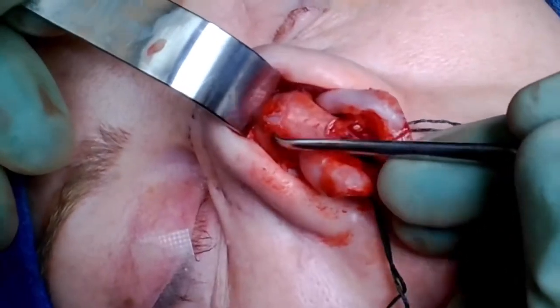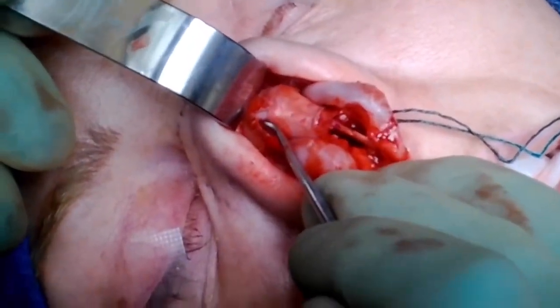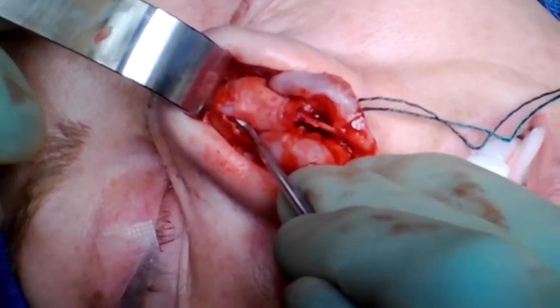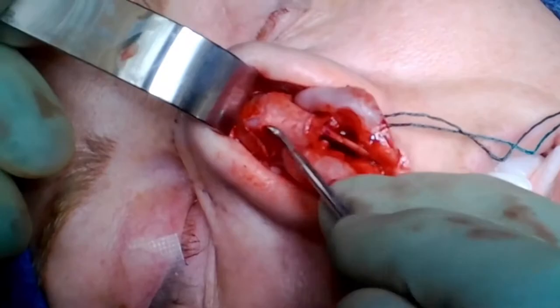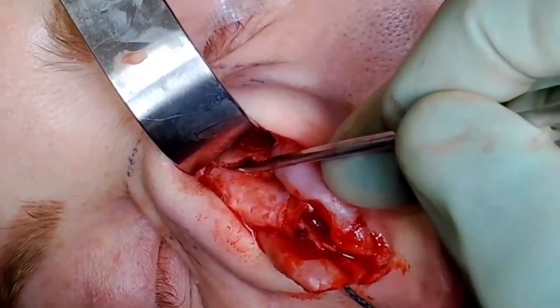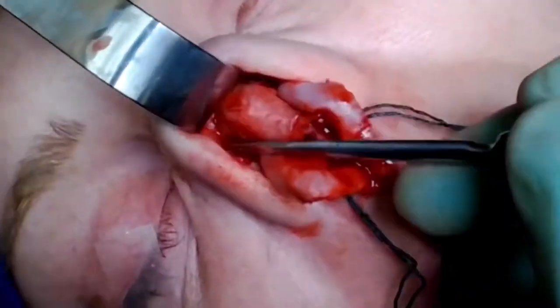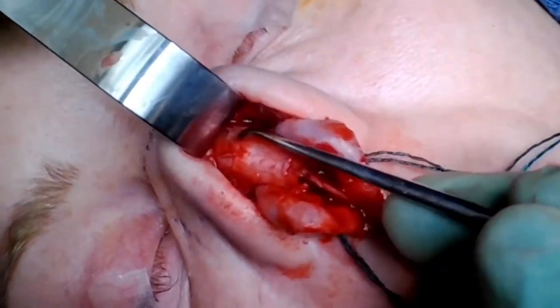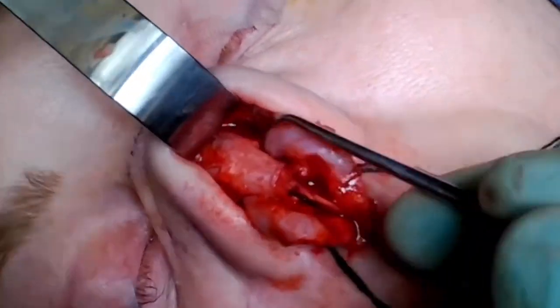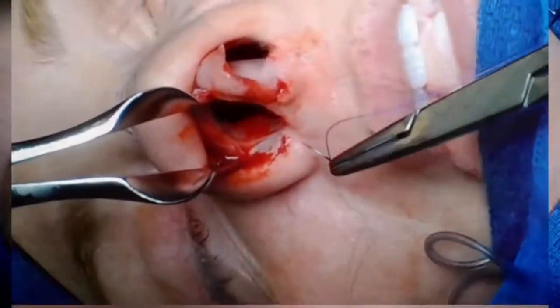This isn't always necessary, but it was in this case — this is a lateral keystone area release. I take a sharp caudal and I'm separating the upper lateral cartilages from the nasal bones. You need to be conservative and go slow. You don't want to damage the cartilage, and you don't want to produce too much instability here. But you do need to separate this area in order for a big hump to come down. So I'm just checking to make sure that I'm happy with the degree of mobility of the cartilaginous dorsum.